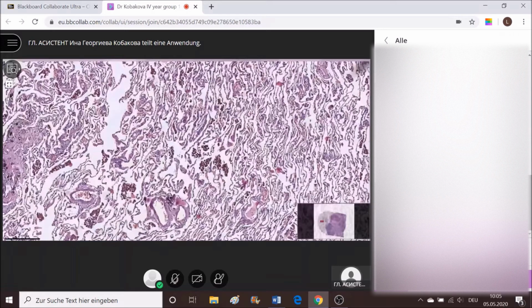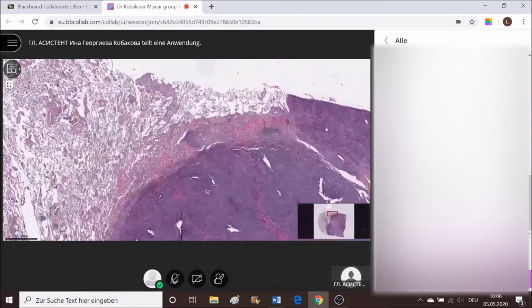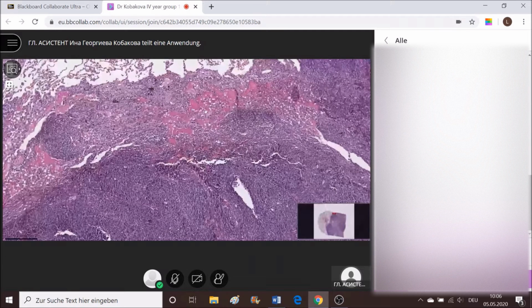Further on the slide, we start with this zone, which is actually a formation of a tumor. This tumor is not well circumscribed, and you can see that there are some hemorrhagic changes at the periphery of the tumor. We see some hemorrhages, edematous changes, inflammatory infiltrate in the form of stromal reaction, which is made of, what are these cells, leukocytes or lymphocytes?